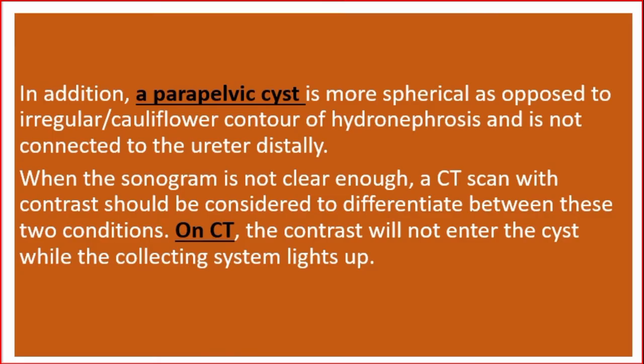When the sonogram is not clear enough, a CT scan with contrast should be considered to differentiate between these two conditions. On CT, the contrast will not enter the cyst, while the collecting system lights up.